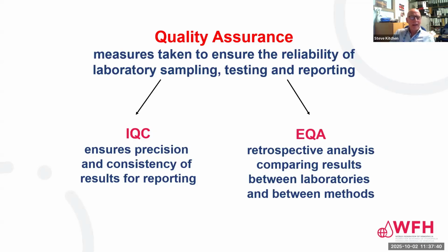Internal quality control, IQC, and we need to do this to help look at the precision and consistency of our results for reporting. So we can use this to say that using the same reagents and methods today, we should be getting more or less the same result as we did yesterday and the day before and so on. So it tells us about the reproducibility. This we should be doing regularly and frequently. And there are some comments on that in the WFH laboratory manual.